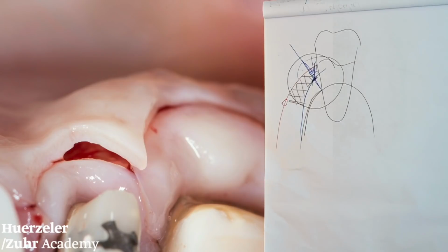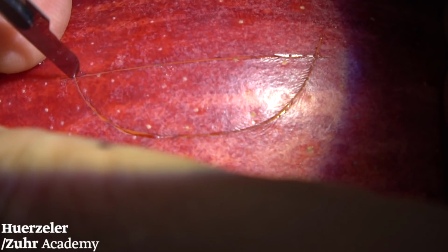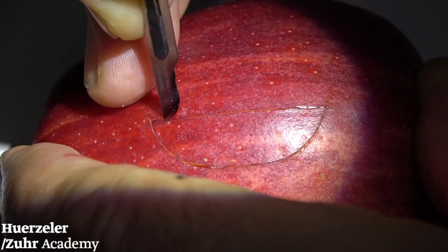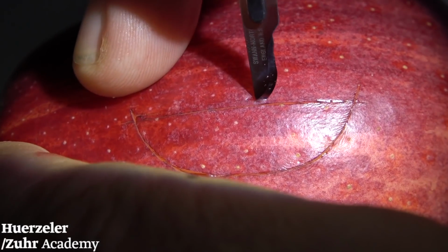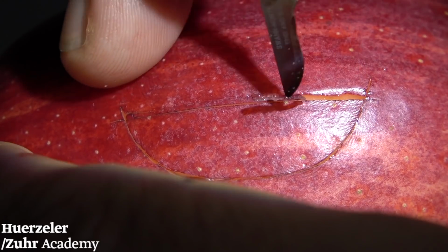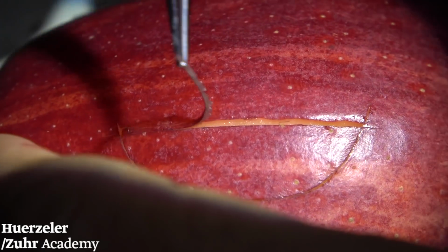Okay, let's go back. That's what I'm doing now. We first do a little cut here. We angulate our blade about 30 degrees. And now I cut a little bit in the tissue, 30 degrees. I follow carefully. This I can do also in human. Now this tissue we take out. You take this out. Very simple, a little cut.